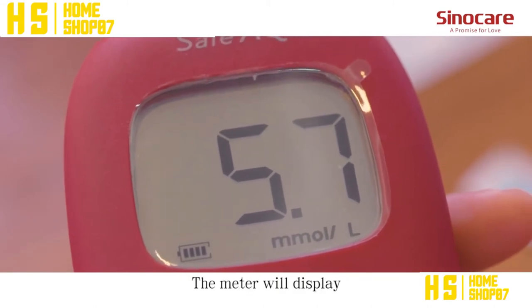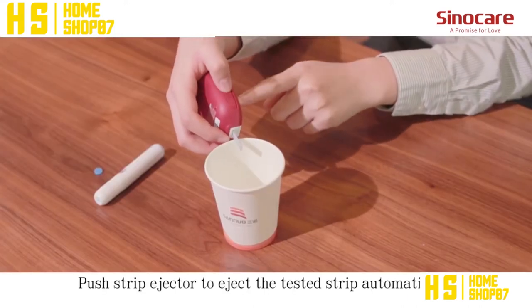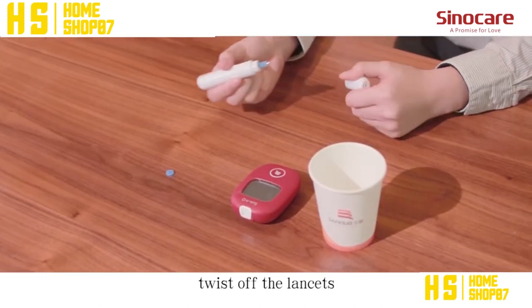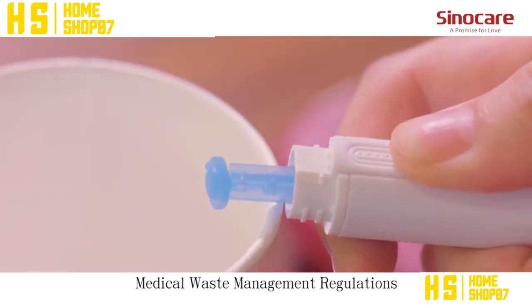Apply the blood sample to the opening of the absorption channel of the test strip until the confirmation window is fully covered with blood. The meter will display your blood glucose value after several seconds. Push the strip ejector to eject the test strip automatically. Twist off the lancet, cover its cap, and place it properly according to medical waste management regulations.